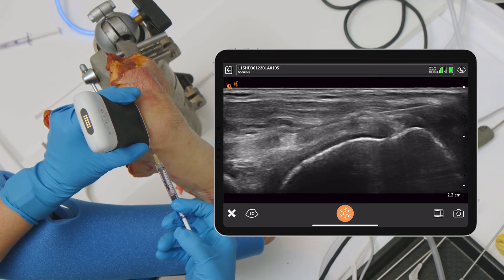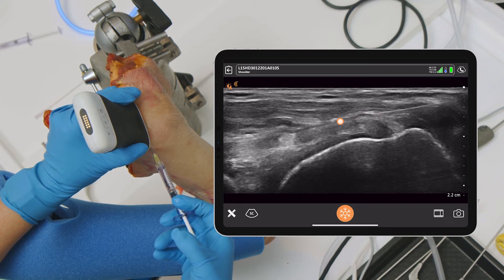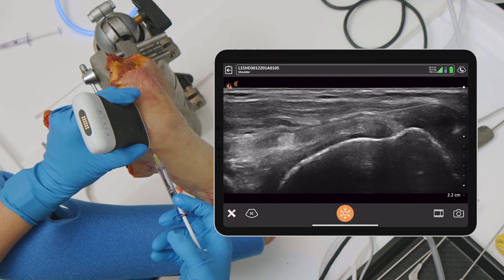So we would inject that spot. You can see it going in — there's a little bit of fluid going into that area, and you can see it migrating all the way from medial to lateral. So we know we're in the subacromial space.